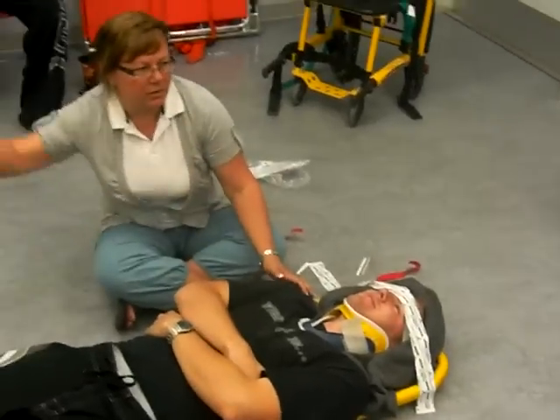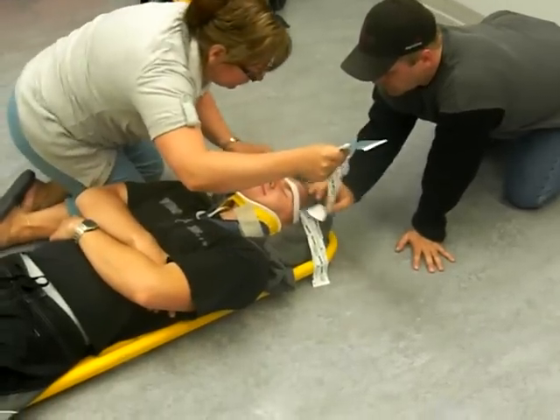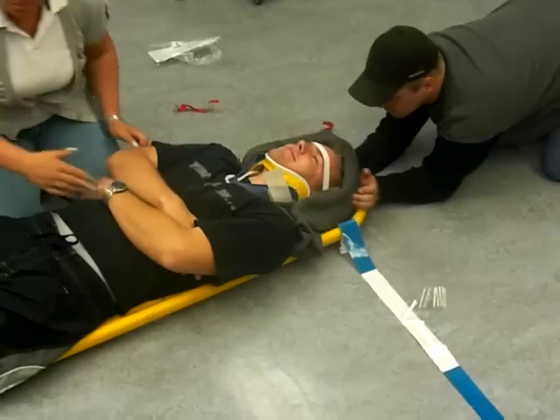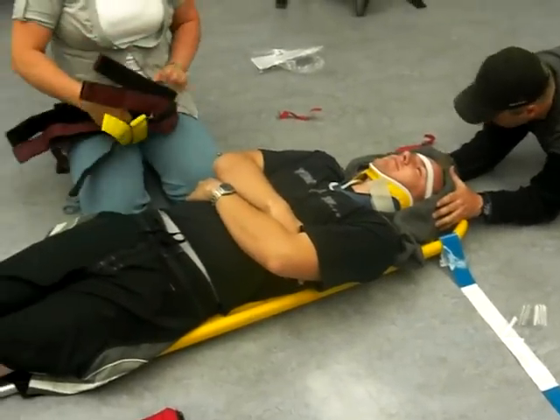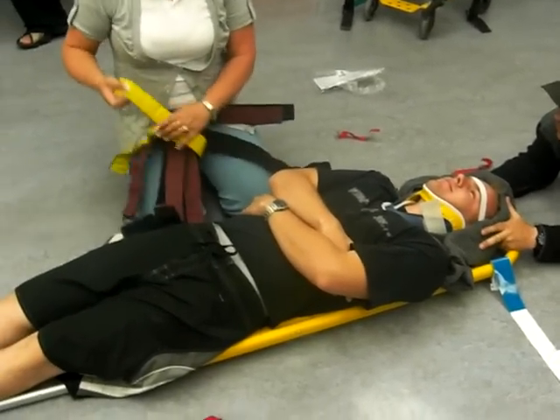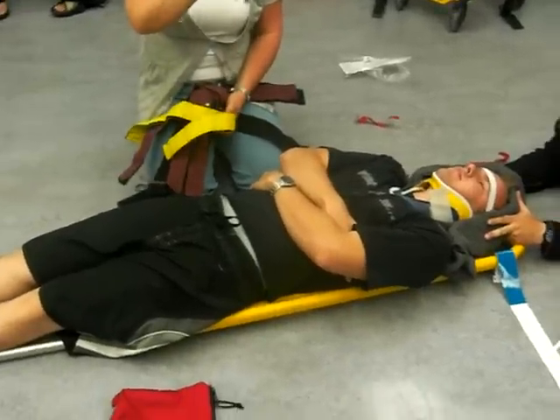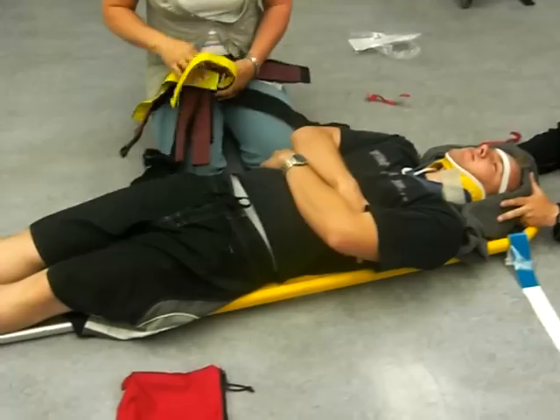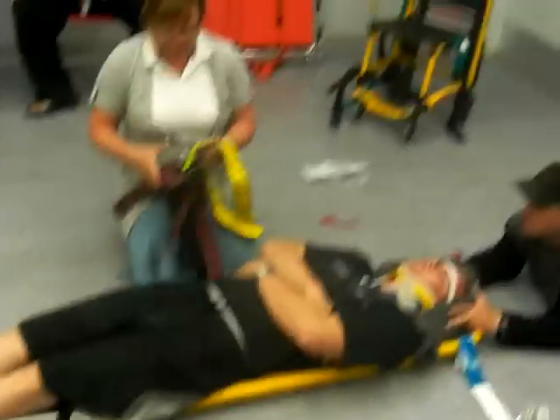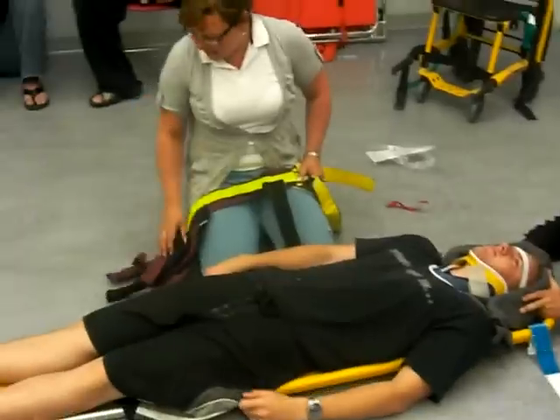Before you do the head, what do we do first? The rest of the body — do the head last. When I get them on the board, what am I going to do? Reassess. ABCs and all critical interventions. So that's what we're going to do. If you guys use that, don't make a sticky mess because I need you guys to go through all the stations. There's going to be about five groups that are going to have to use it. Where's my partner? There you are.